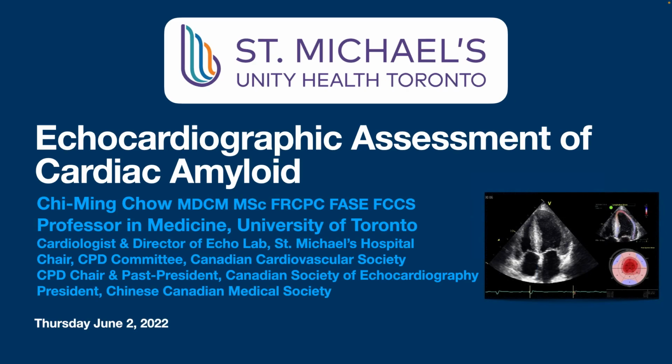I'm going to talk about the echocardiographic assessment of cardiac amyloid, one of the hotter topics these days in the field of echo. And certainly, we're very fortunate at our hospital that Dr. Gordon Moe and Haven Shura have really taken on to form the cardiac amyloid clinic. It's really fantastic. Now we have a home to help patients with this rather rare and often misdiagnosed condition.